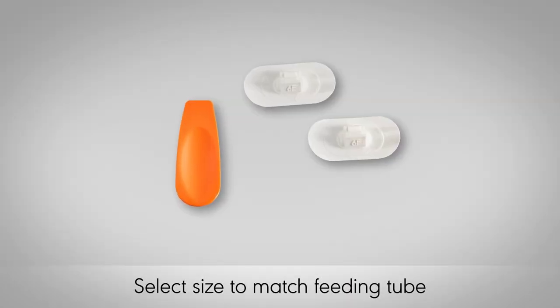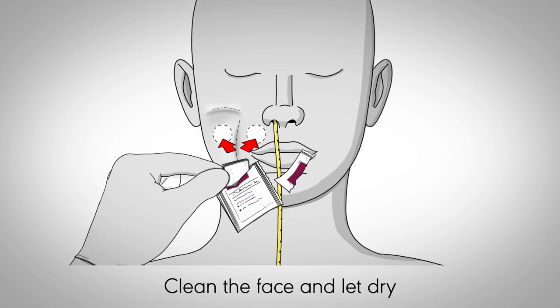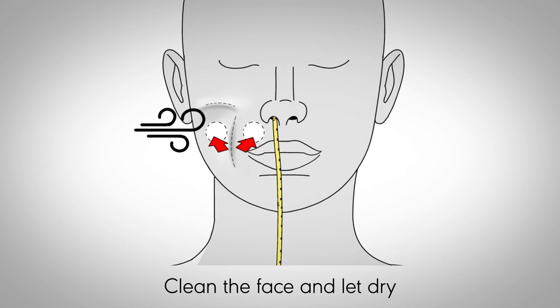Select the appropriate size anchor set to match the feeding tube for a secure fit. Don appropriate PPE. Before beginning the procedure, clean the area of the face where the tube anchors will be placed following facility protocol, and then let the skin dry.